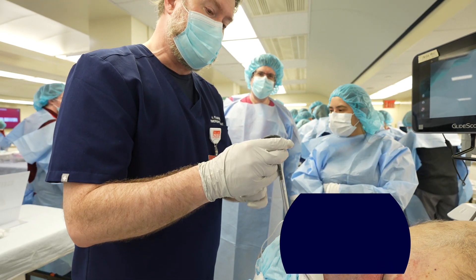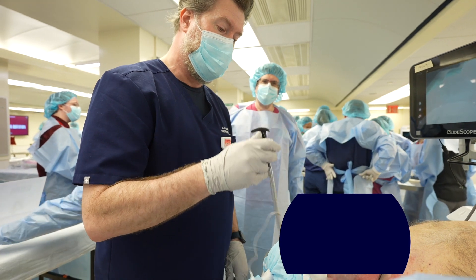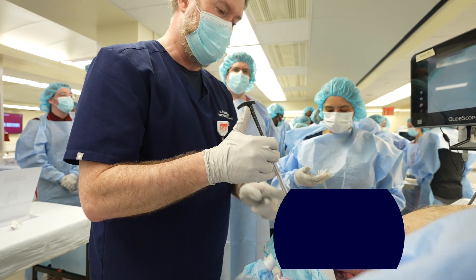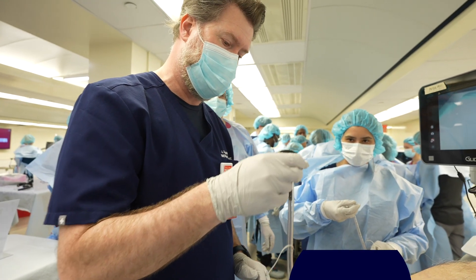This allows you to rotate the tube side to side and up and down. And now instead of just doing a simple push, you're doing this — the stylet is going up and the tube is going into the trachea at the same time, all one smooth motion.